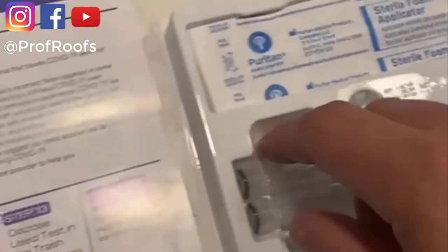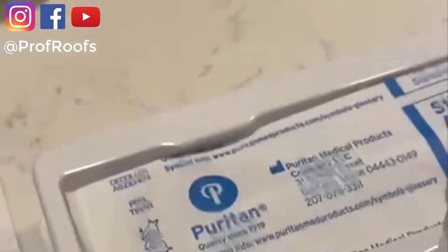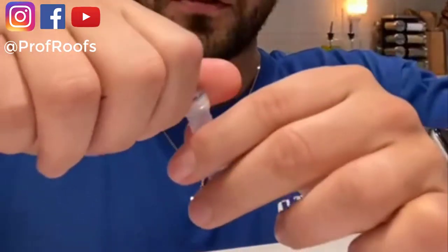Right, so we have the tube right here. This is where the tube is going to go, the test tube. This is the test strip. This is this. I'll put it there. Let's see. Okay, first, wash your hands. Lava tus manos. Después, you see this? You're going to take the tube here, and you're going to open it, and then you're going to place it in here. So lo vas a abrir y lo vas a meter acá. So let's open this.